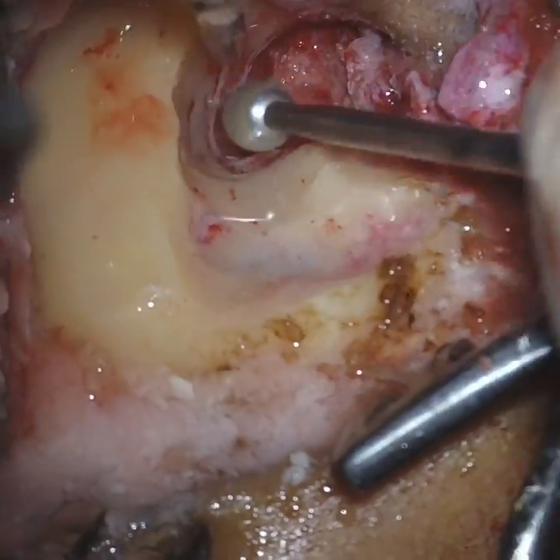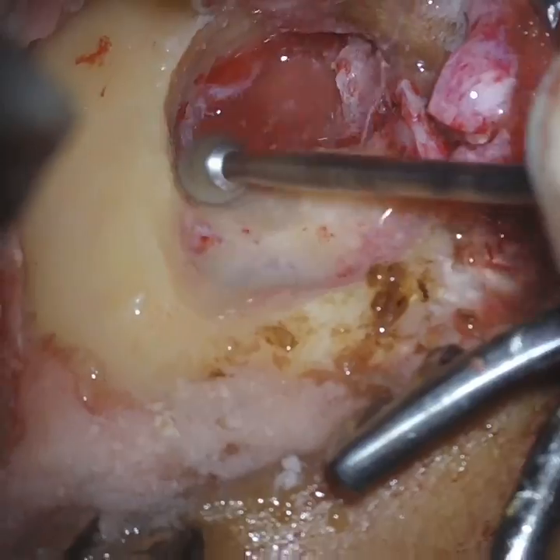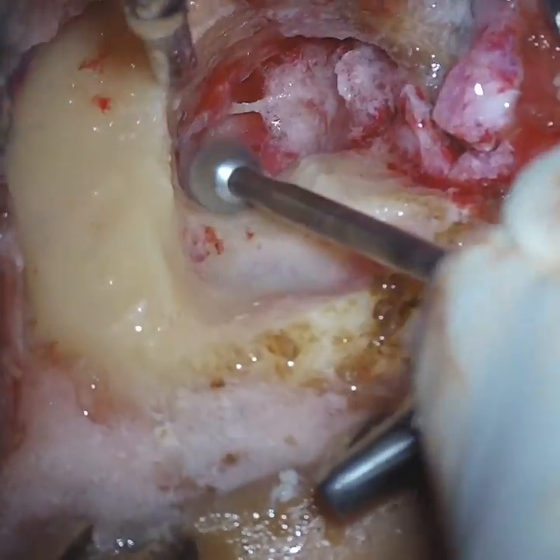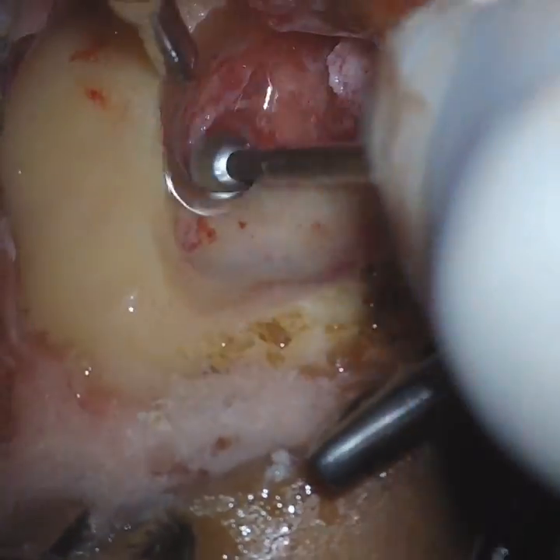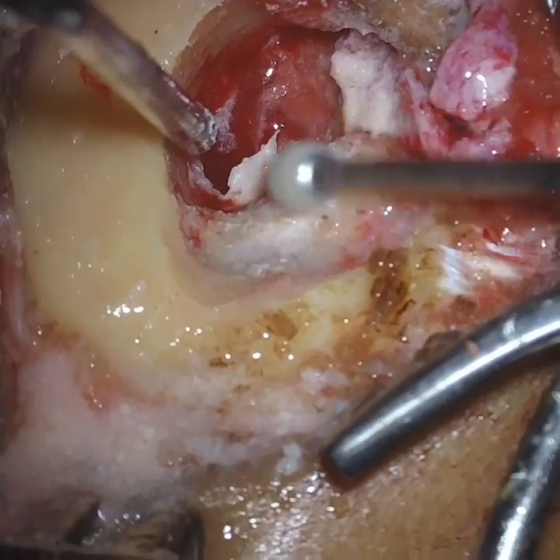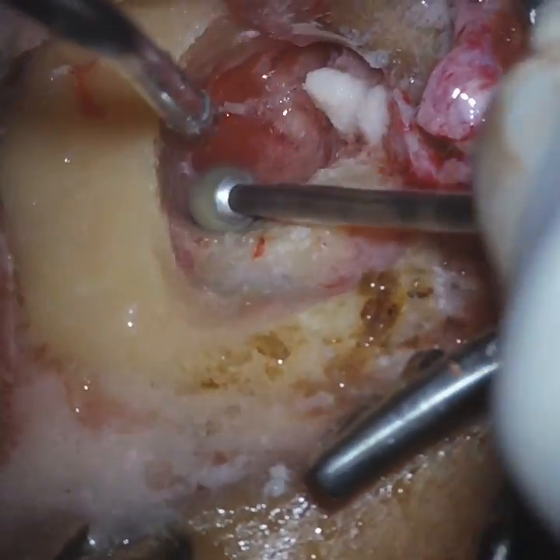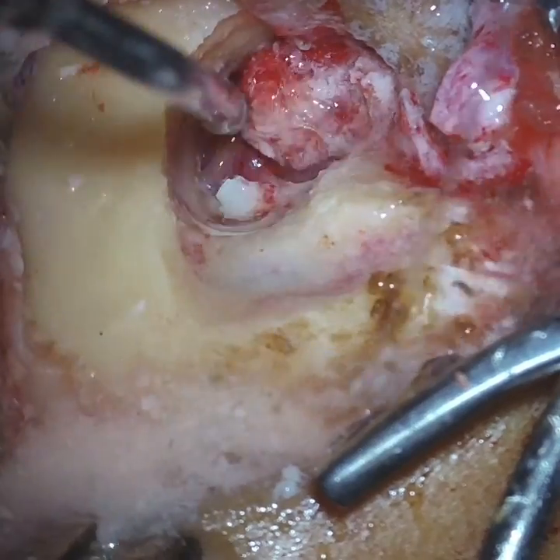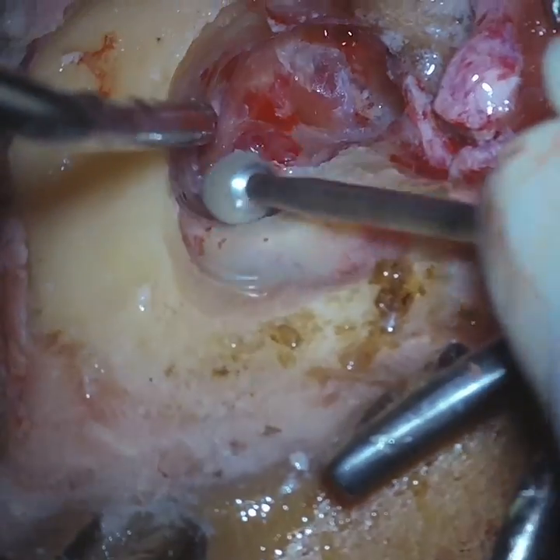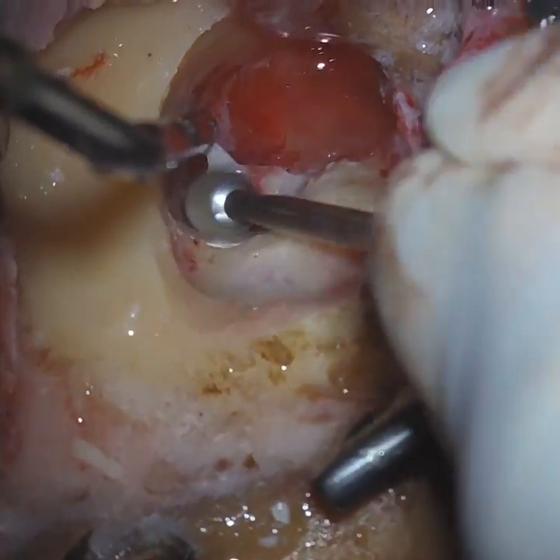In this patient you see we have slowly started to expose the mastoid cavity. And now very important is drilling the facial area. Here we are exposing the facial nerve. There are two ways of dealing with this, either outside in or inside out. Here, because we had to collect the bone dust earlier, and that bone dust has to be clean, we decided to have the outside in method. Whichever method you are comfortable with, you can follow for mastoid surgery.